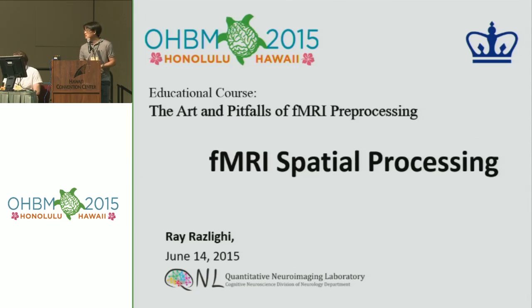To just follow up on that question, it is true that most of the publicly available data sets don't report what kind of interleave they used. But there are techniques, especially the one that we developed in our lab, that let you find that parameter from the data itself. We developed that technique, and it's available online. It's just a simple code that computes the correlation of the signal between different slices.